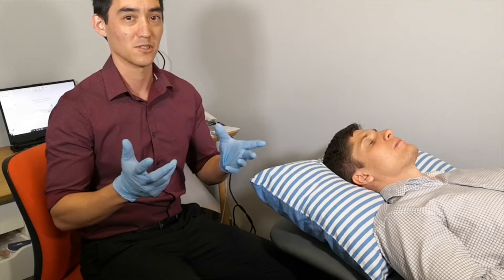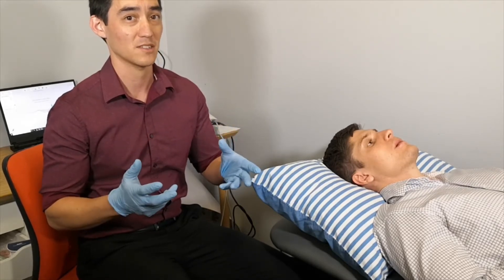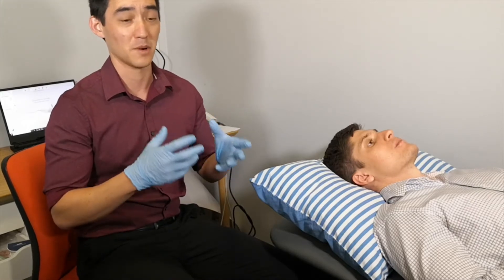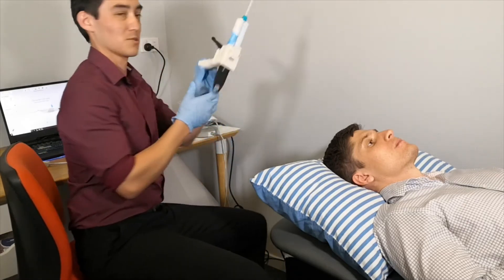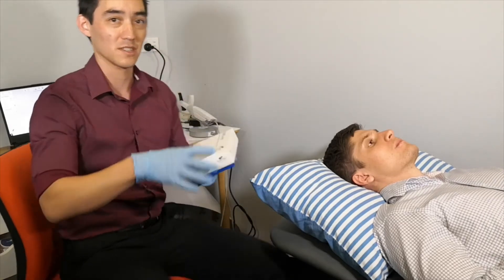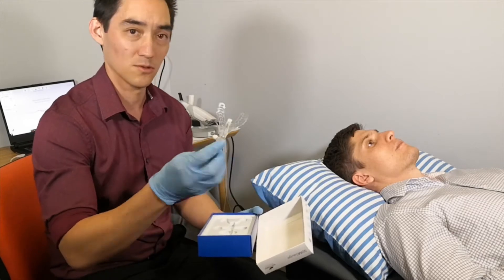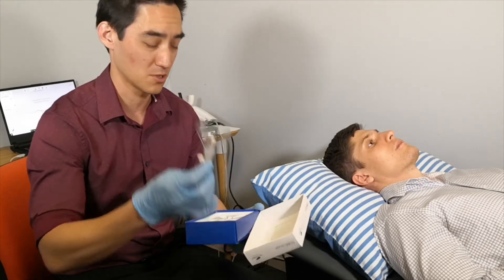Now that they're done, we move on to the bite registration. We can do a bite registration scan — that involves a little bit of impression material, so you'll want a bite registration material and your typical sort of bite registration gun. I'll just demonstrate the SOM gauge. We've got the actual SOM gauge here. Some people know of the George gauge as well.